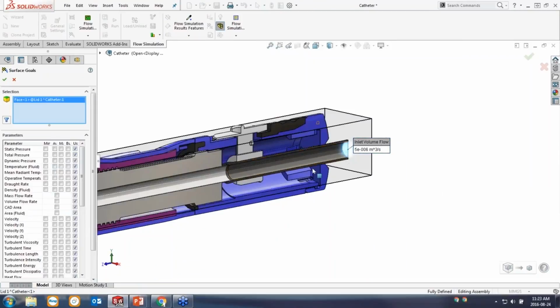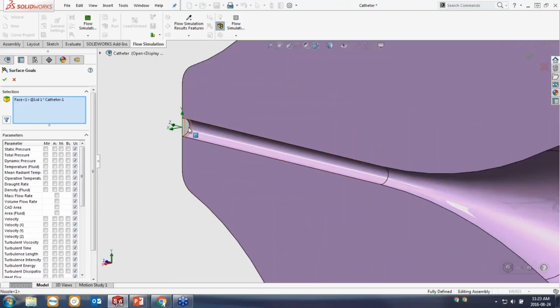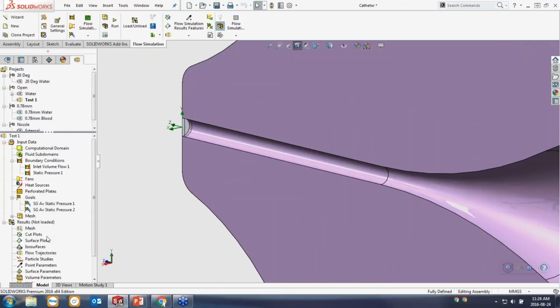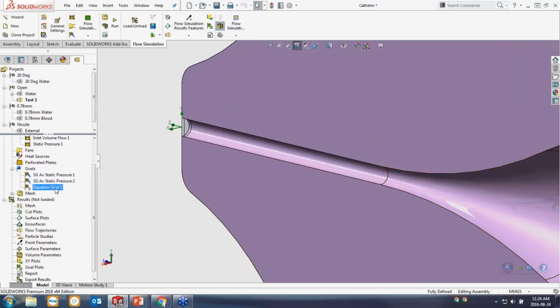One of the key things we wanted to measure was the back pressure. And so I'm going to grab both the inlet and the outlet face, and I'm going to monitor the pressure on both of these faces. Create a couple of goals for that. I can actually create an equation goal based off of those that's going to monitor the differential between them. And so I'm creating a third goal here, which is going to be based on those previous goals that I set. I'm going to take the pressure at the inlet, and I'm going to use that to subtract the pressure at the outlet, which should be atmospheric based on my boundary condition. And by applying that, I now have a new equation goal. And we'll just rename that quickly and call that back pressure.